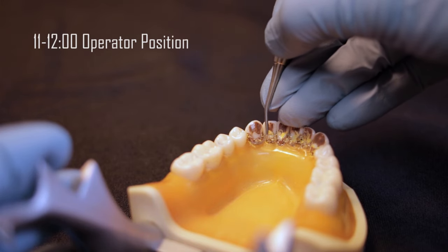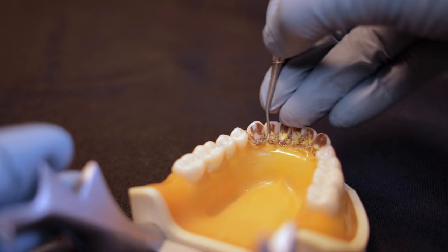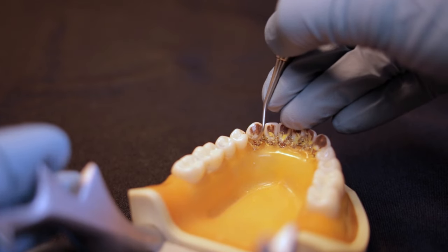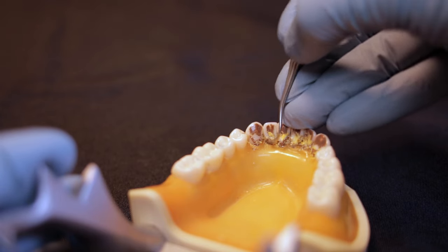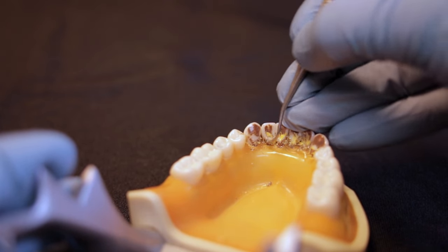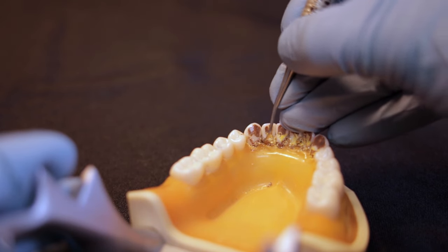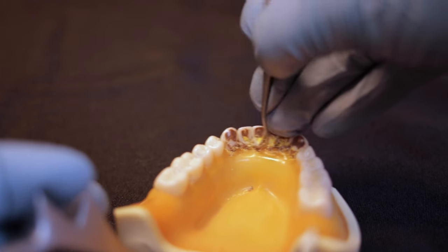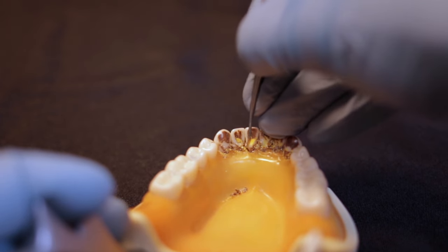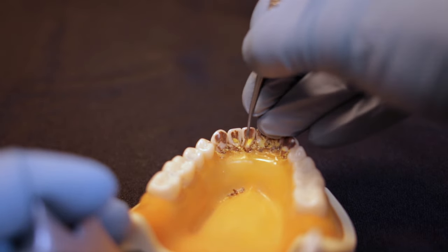We're going to start out by getting interproximal first, working on surfaces away from us. I like to use something nice and skinny for these lower anterior teeth, so I'm using the sickle scaler. Starting at the line angle, rolling interproximal and going all the way up to the contact. With a sickle scaler we're going to have a little bit of an angle to the instrument.